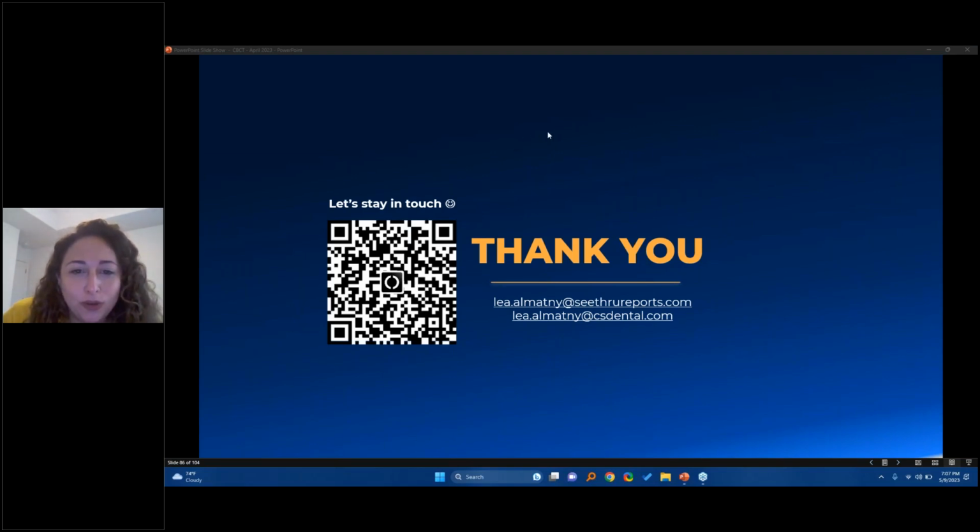I need to buy a new computer to play scans from my oral surgeon that treats my patients. Please give me the specs that I would need to get a quality view, and if you have or recommend the best brand to consider. I can tell you which brand I use. I use Lenovo. I've used MSI in the past, but it's really more just about the specs that you have.